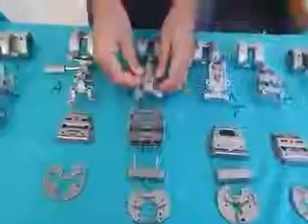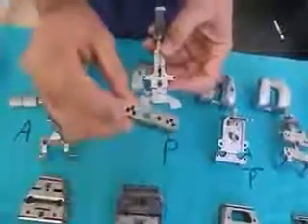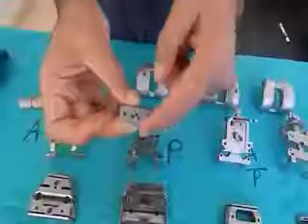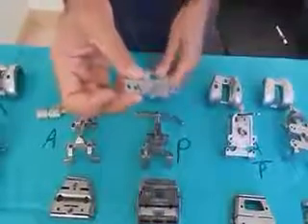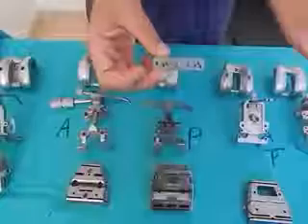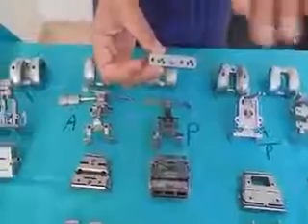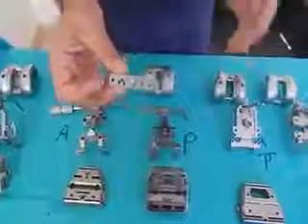Hypothetically, suppose you are between 65 and 67.5 and you put your pins as per 67.5, then want to come to 65. You use this instrument, come down two millimeters so that you are flush with the anterior surface and are not cutting too much posteriorly. Posteriorly medially, we should cut about 9 or 10 millimeters — that is the thickness of the distal femur condyle. Cutting that much posterior medial balances the flexion and extension gap. Then the tibia cut balances both gaps equally. It's important to reference your posterior medial condyle at about 9–10 mm, the same as the thickness of your distal femur cut.